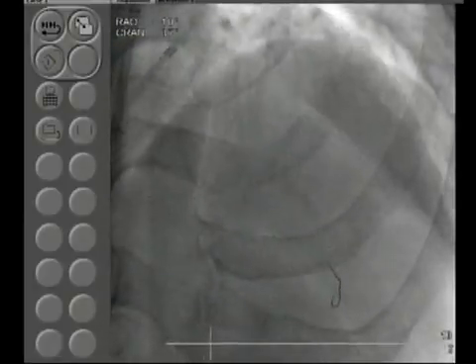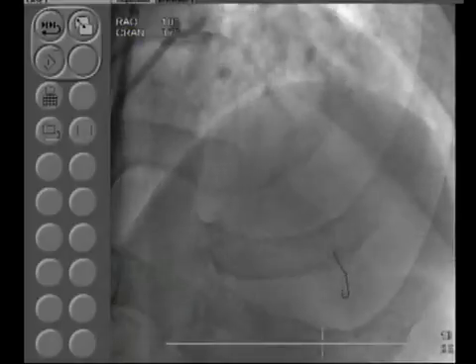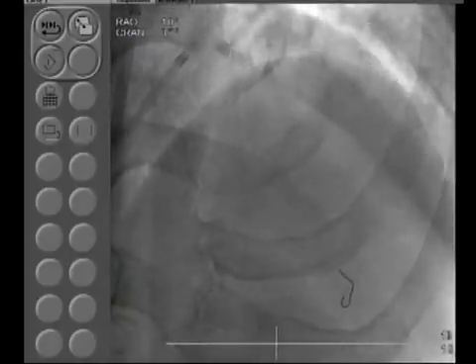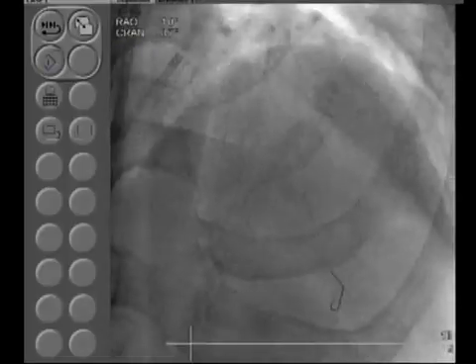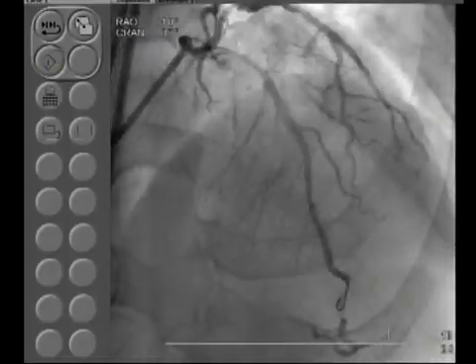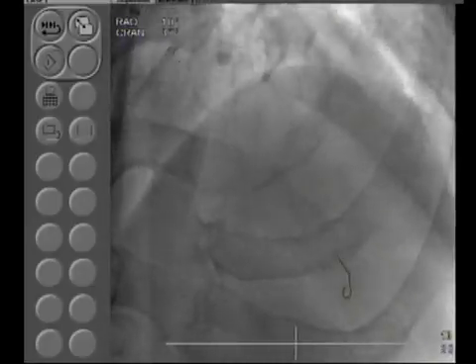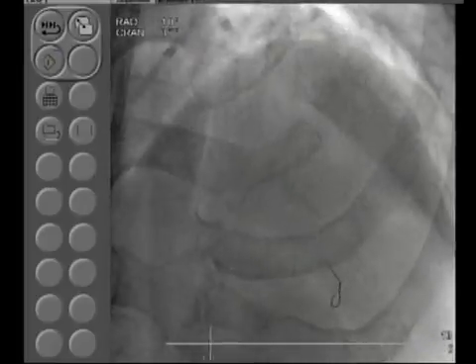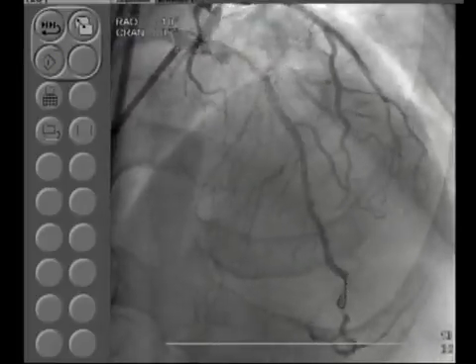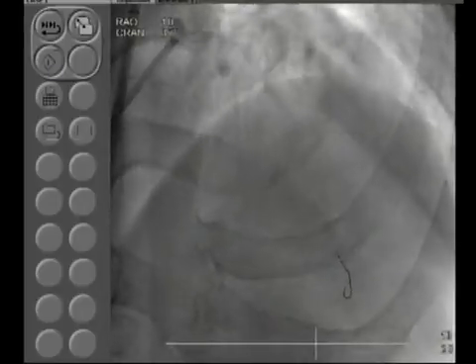Good. See the last few 1 millimeter, but that's okay. It means we gave it gently. That's the point we want to make, that although we have a clear-cut planned strategy in these complex cases, as the case goes along the directions can change, particularly depending on what you encountered in that particular case. Like in this case, we were ready to go with the steps quickly again with the 2.0 bar. Good.